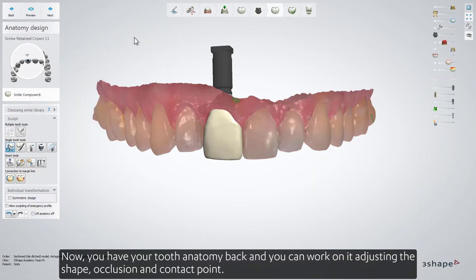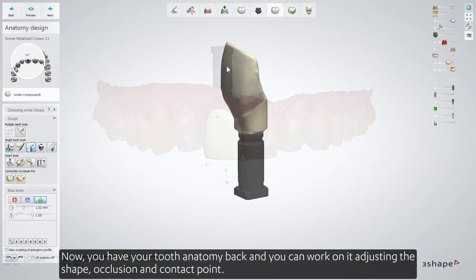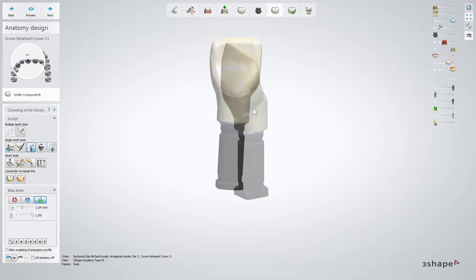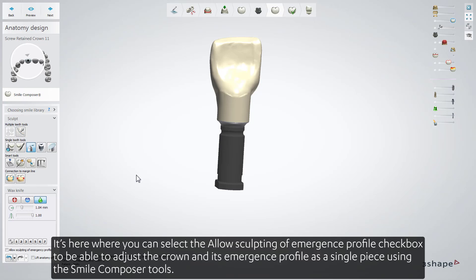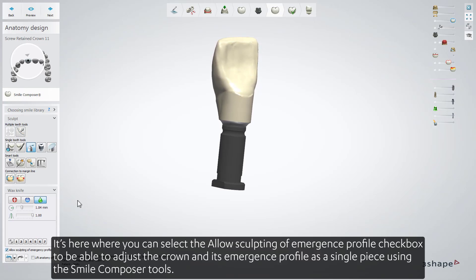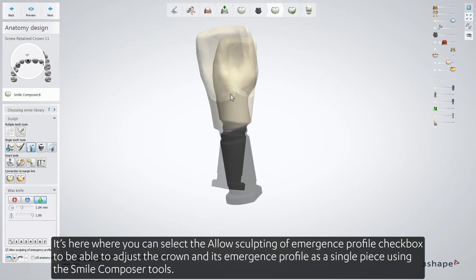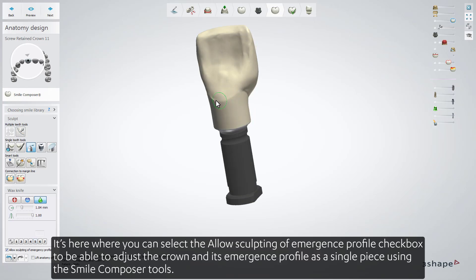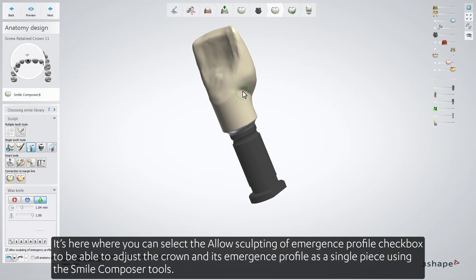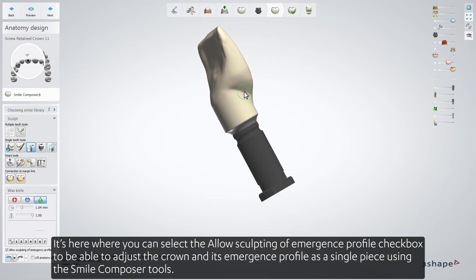Now you have your tooth anatomy back, and you can work on it, adjusting the shape, occlusion, and contact point. It's here where you can select the Allow Sculpting of Emergence Profile checkbox to be able to adjust the crown and its emergence profile as a single piece, using the Smile Composer tools.